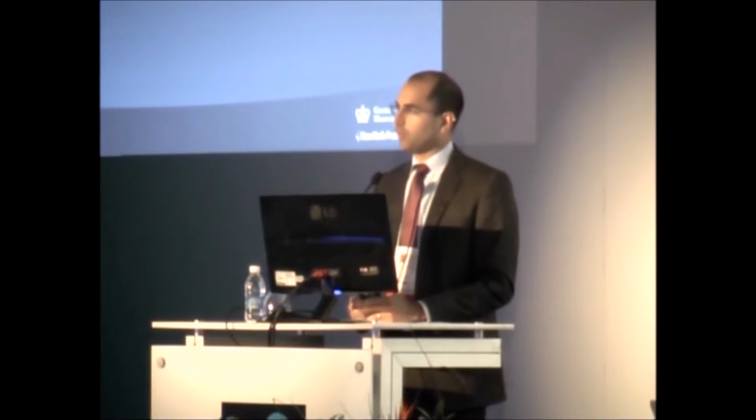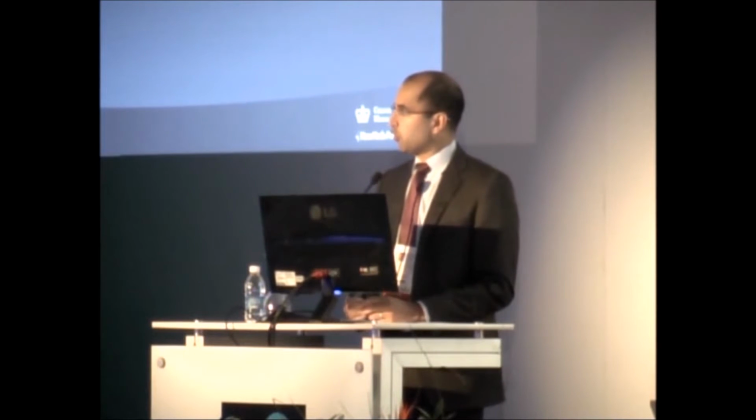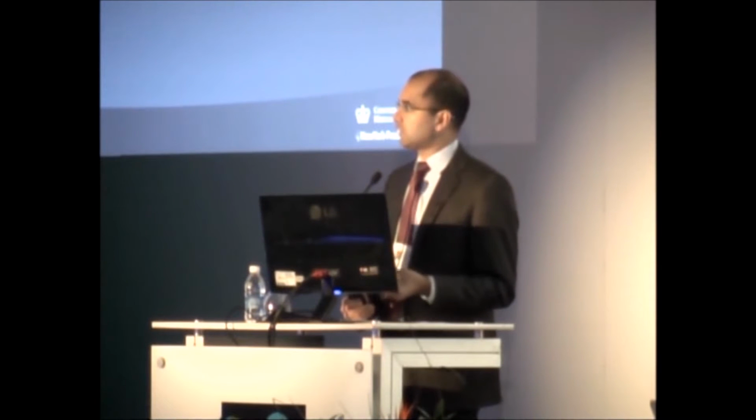So to go through each of these topics somewhat quickly, let's start off first with ischemia-guided or physiology-guided PCI. We certainly believe that this is now the gold standard for how we treat coronary lesions. I don't think you have to do physiology on every lesion. I'll show you a figure that summarizes when I think it ought to be done. But it's important to do because I'll show you two case examples of opposite examples.